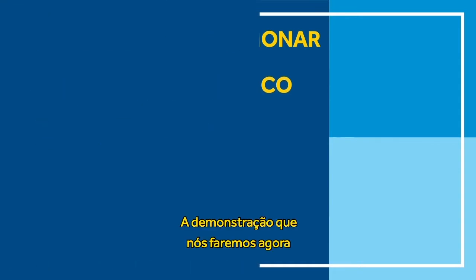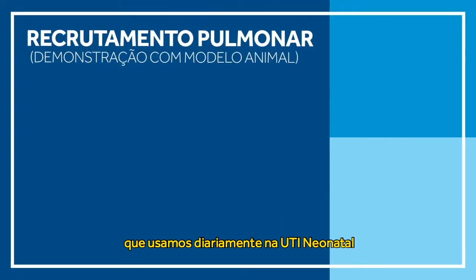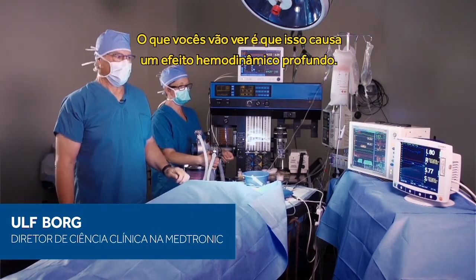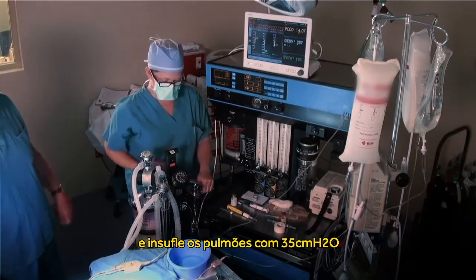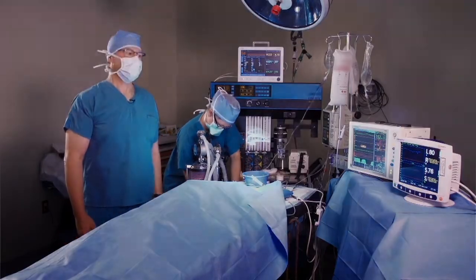The demonstration we're going to do right now is the recruitment maneuver. This is a maneuver that's done every day in the NICU to reinflate the lungs of the baby. And you will see that we're going to have profound hemodynamic effects. So I'm going to ask you to stop ventilation and inflate the lungs to 35 centimeters of water. And we're going to hold that for 40 seconds.